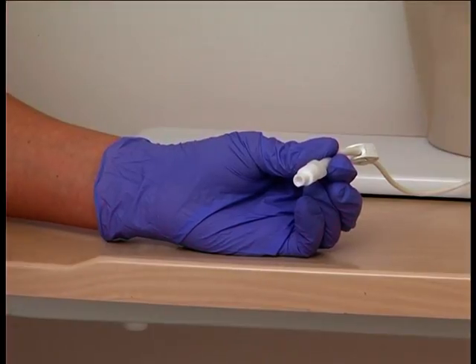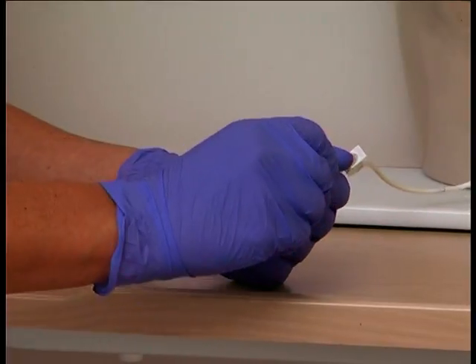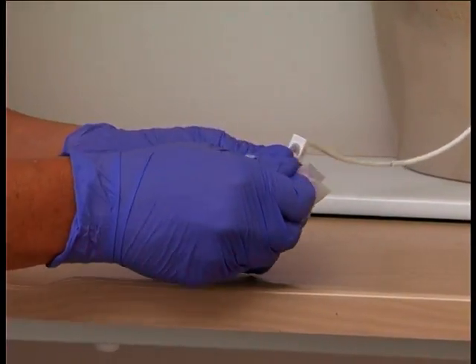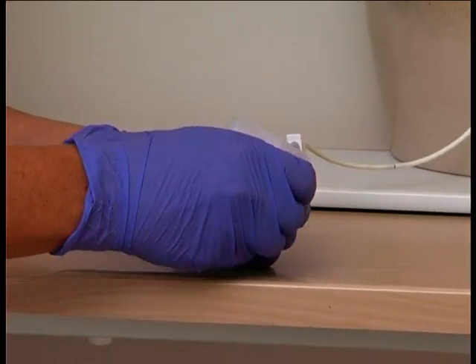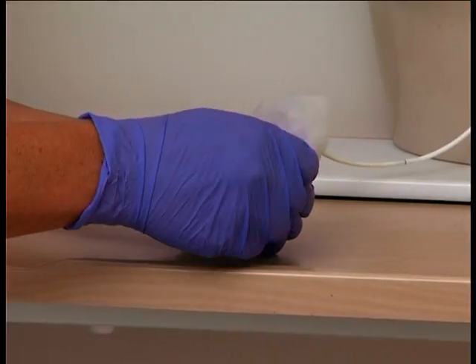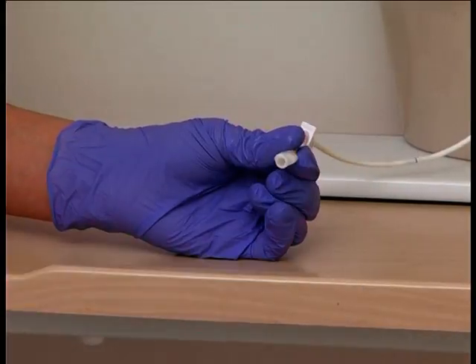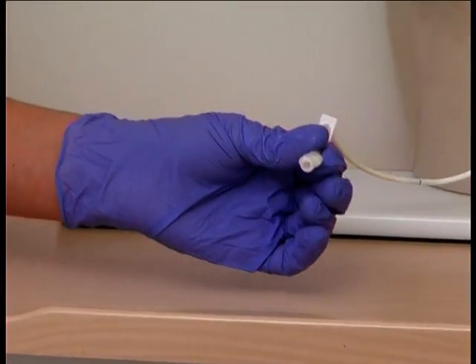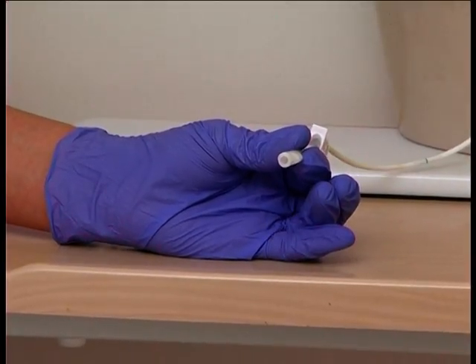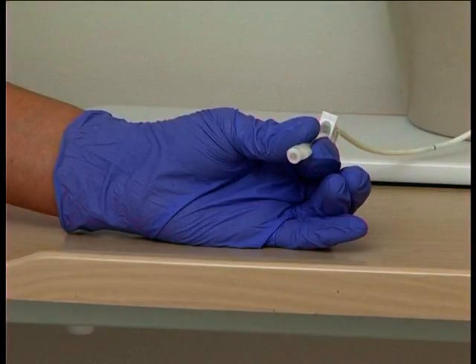Make sure that the CVC is clamped. Remove the catheter cap and throw it in the rubbish bag. Clean the exposed CVC hub using a CHG wipe for 10 to 15 seconds. Throw the CHG wipe into the rubbish bag. Allow the CVC hub to dry, taking care not to touch the hub and, if possible, keeping it pointing downwards so that dust cannot fall onto it.